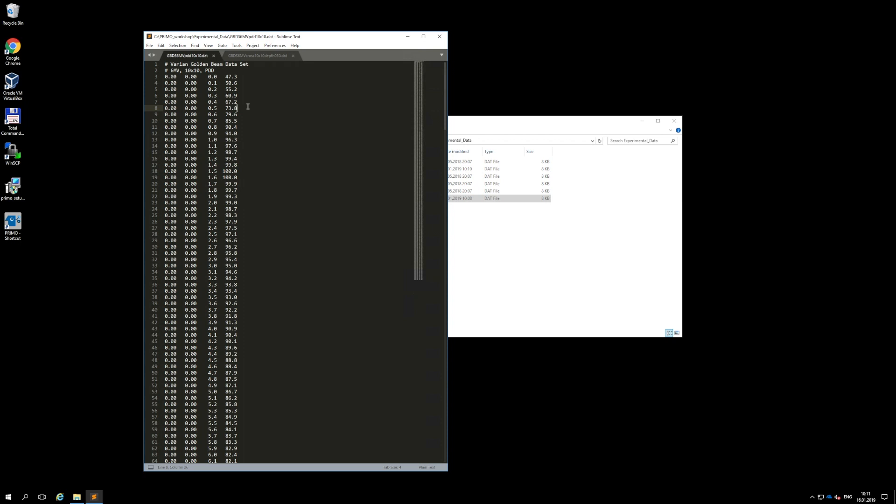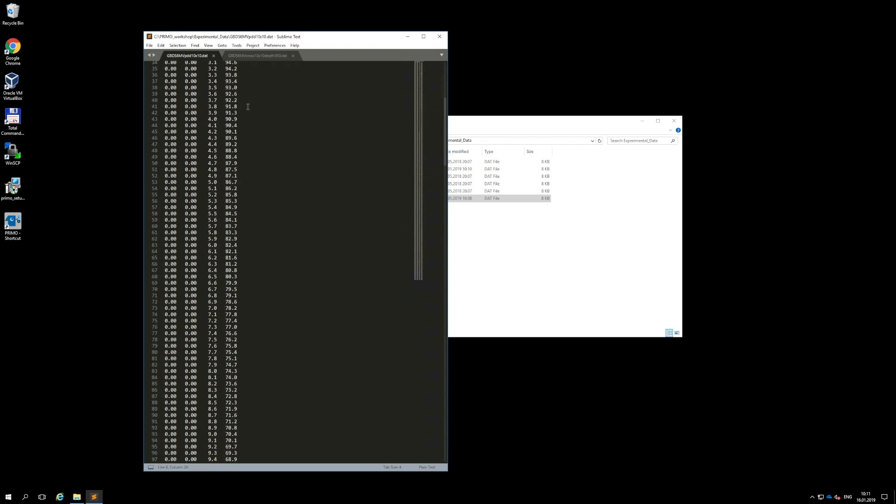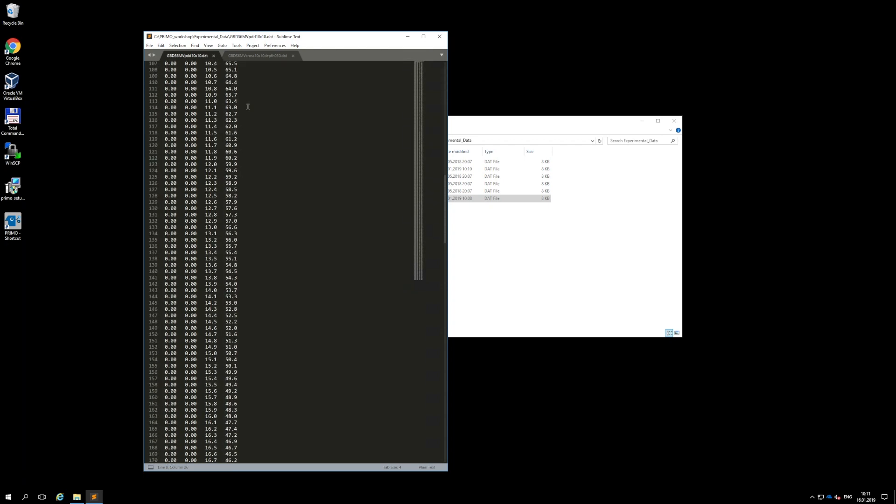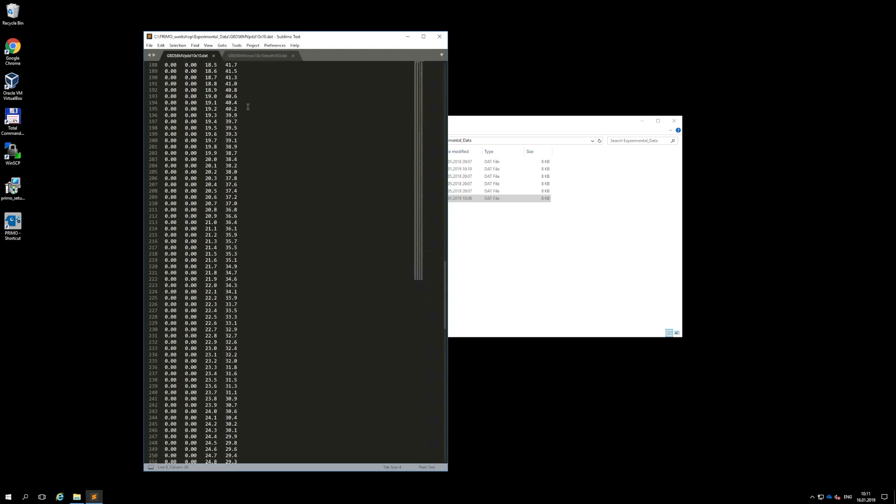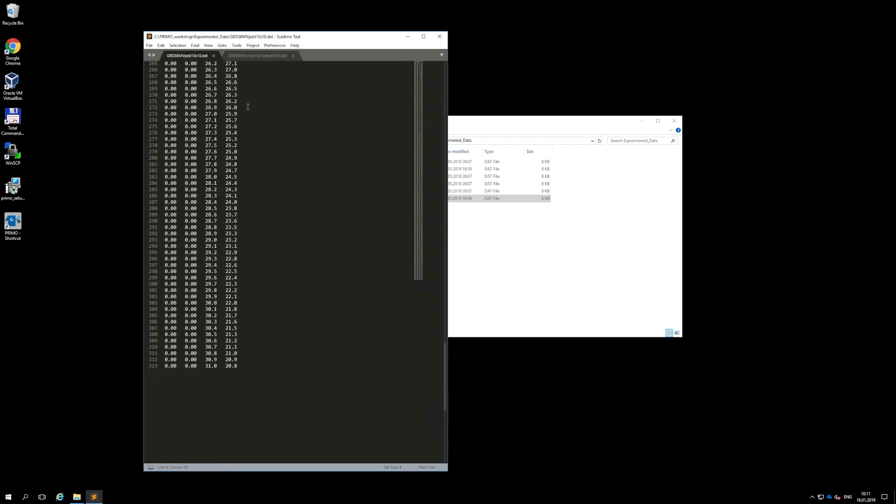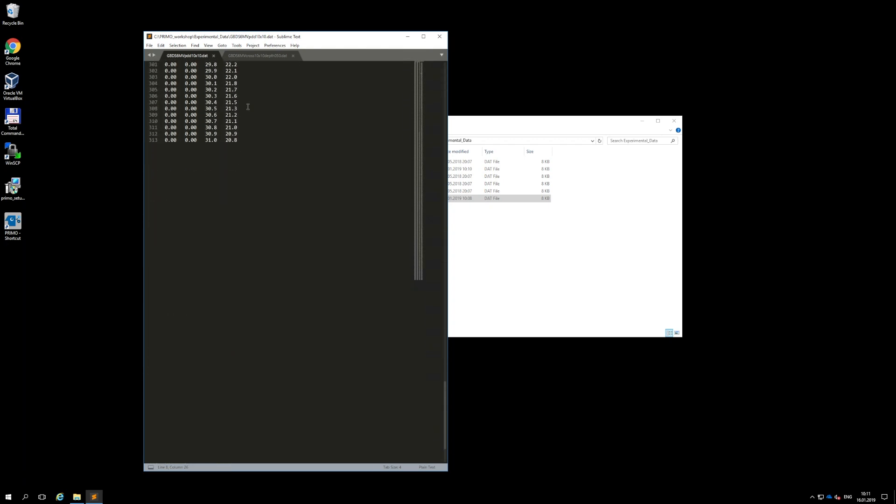Each line ends with a carriage return. The file shown on the screen corresponds to a centered depth-dose distribution. This is evident from the fact that x and y columns are 0, while the values from the z column increase from 0 up to 31 centimeters.